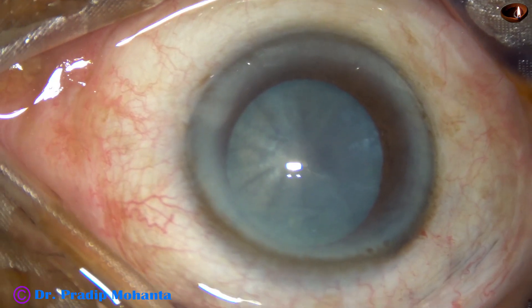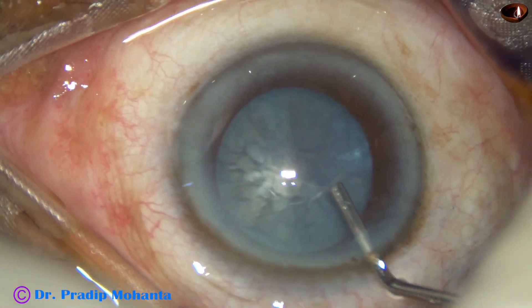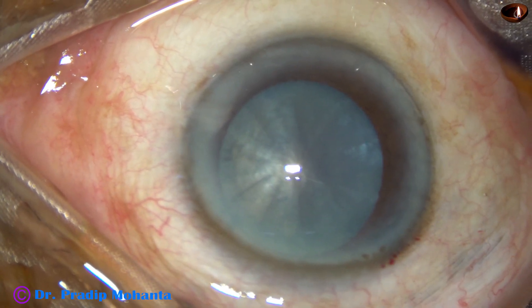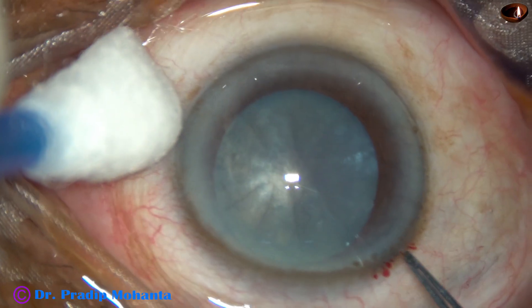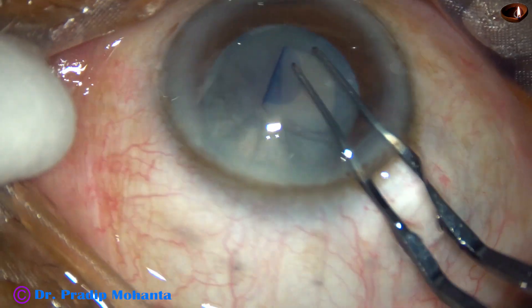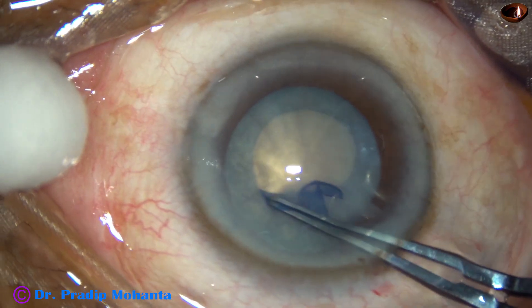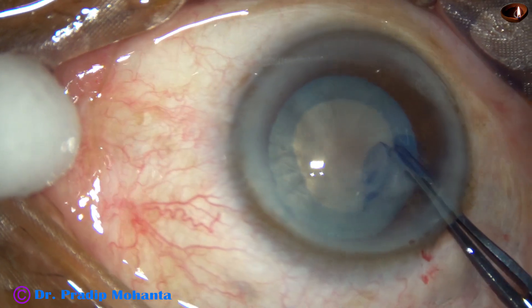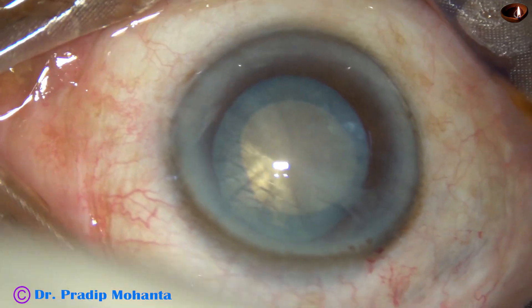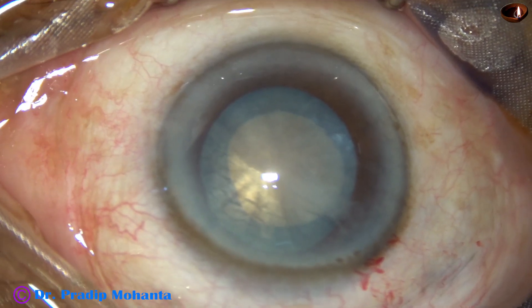Viscoelastic is used to fill the anterior chamber. This is 2% hydroxypropylmethylcellulose. I then use utrata forceps to perform the capsulorhexis. I had no idea about how hard the nucleus is, and the size of this rhexis has been about 4.75 mm on the smaller side.